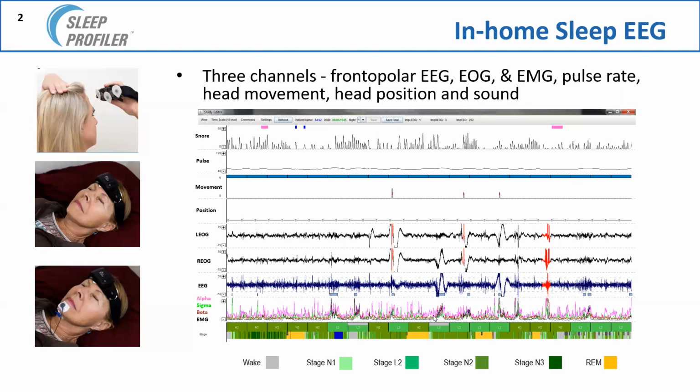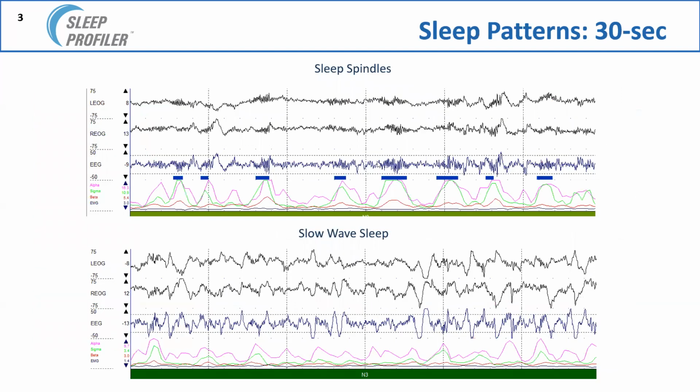Now, what we do is we try and teach people to primarily stage initially looking at the signals on a 10-minute screen, because as I'll show you in a minute, the auto scoring is generally quite accurate, and then going into periods where it may require a look on a 30-second screen. In this example, we see a signal that is staged light sleep because there's a cortical arousal, but it also has a gray stripe indicating it might be awake. So if we go in and see that the wake period extends beyond 15 seconds, we would then go in and manually edit it.